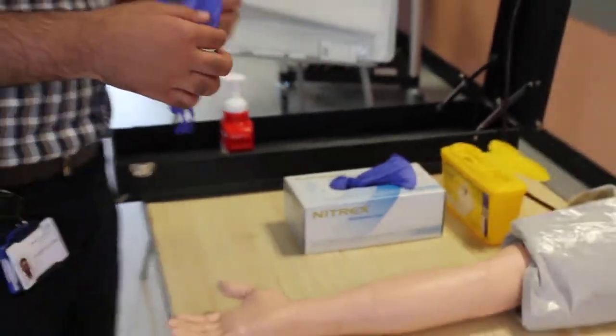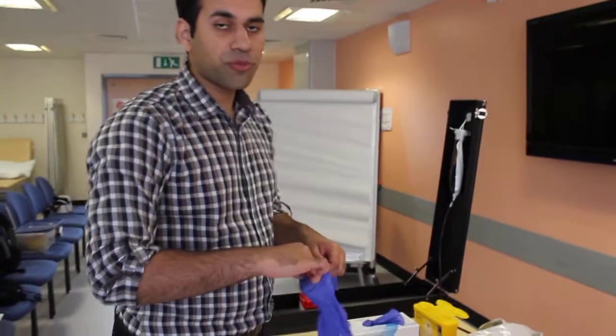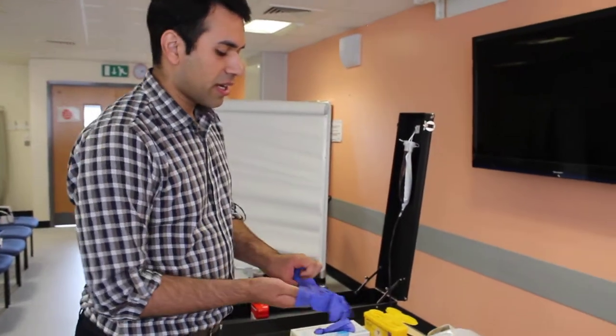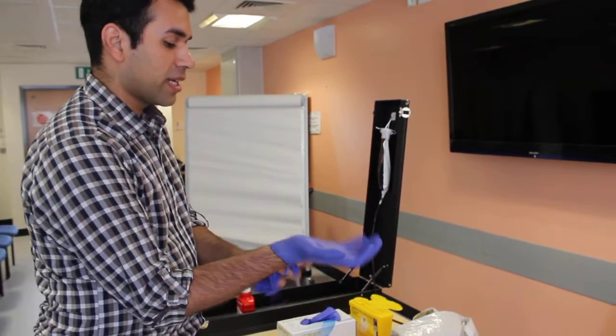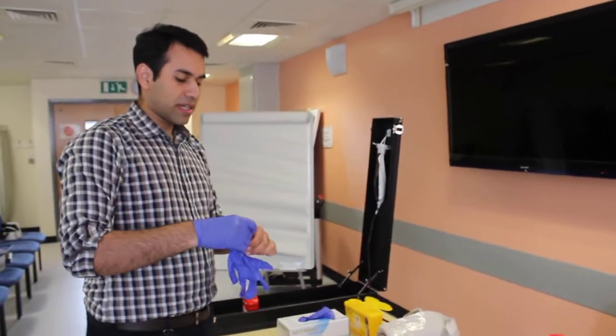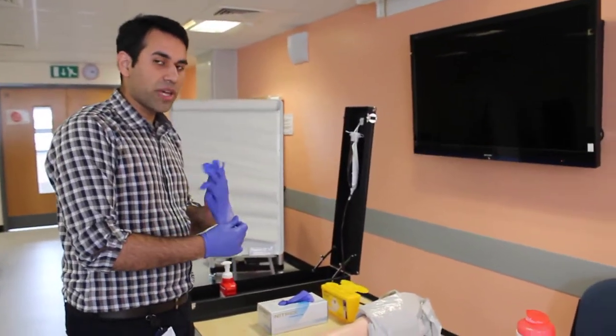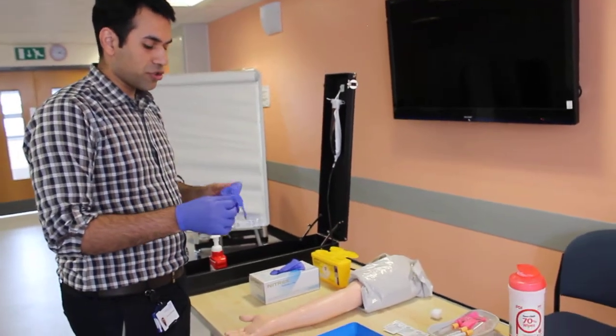How the examination starts is you explain the procedure to the patient and take consent. A verbal consent is enough. After that, you check the identity of the patient and introduce yourself.